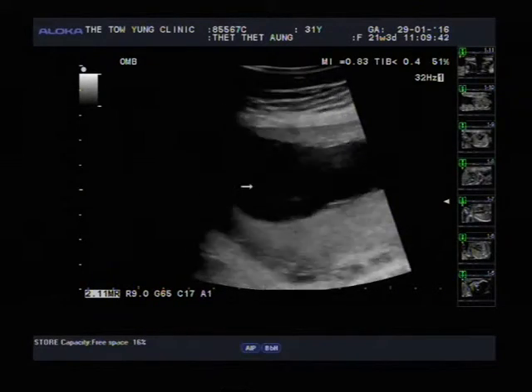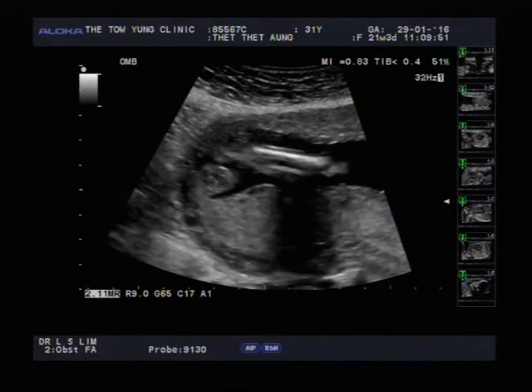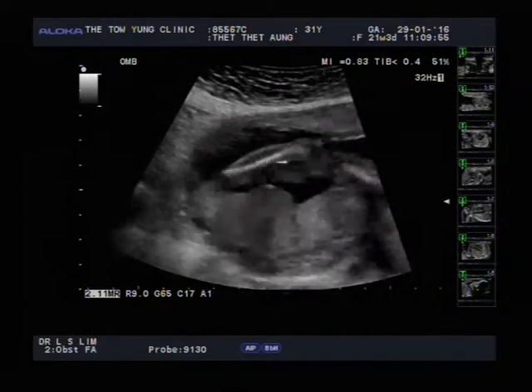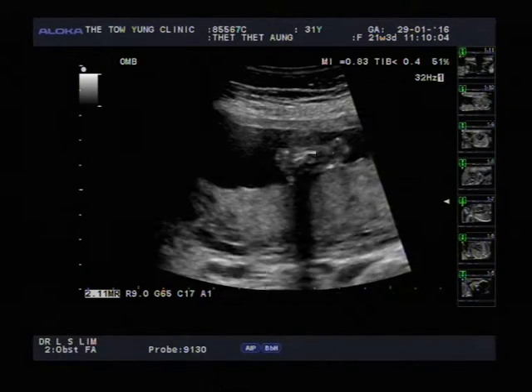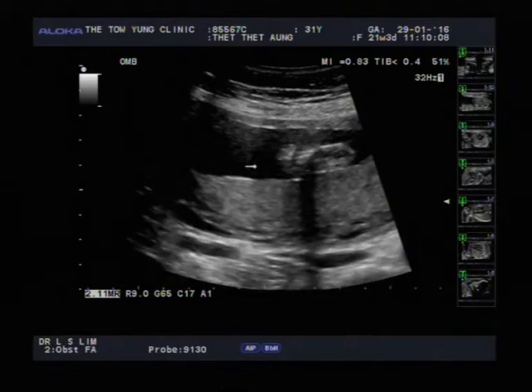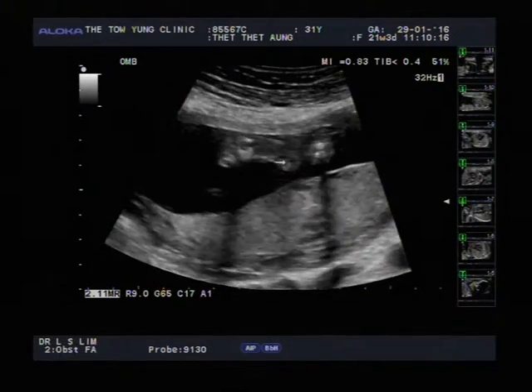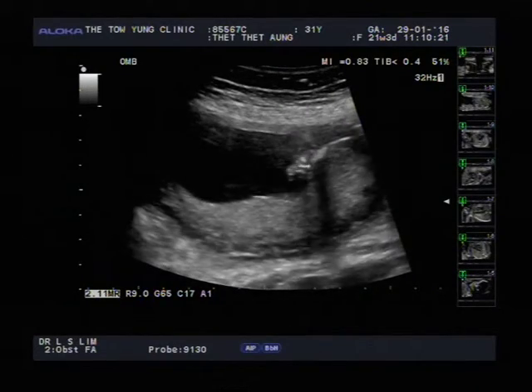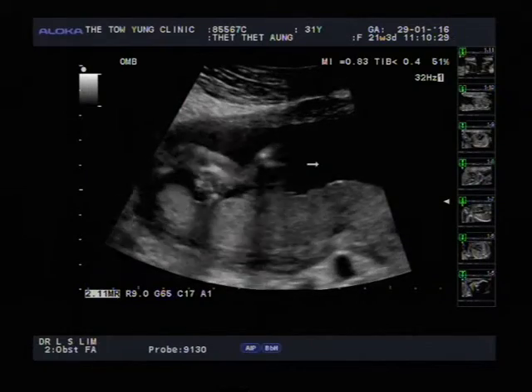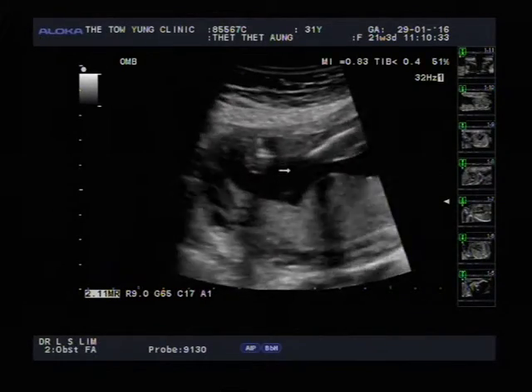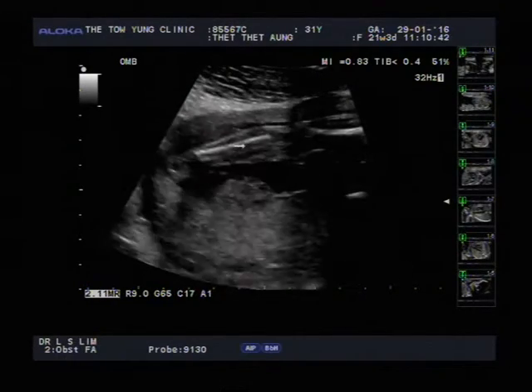After this we'll look at the baby's feet. Going back — one leg is over here, the other leg is on top. There are two bones from the knee to the ankle. We've seen the baby's two legs. Now the baby's feet — can you see the foot? The heel is there and the toes are there. The baby keeps moving but the foot looks normal. There's no evidence of club feet — club feet would make the foot look like the head of a golf club. These are normal-looking feet.